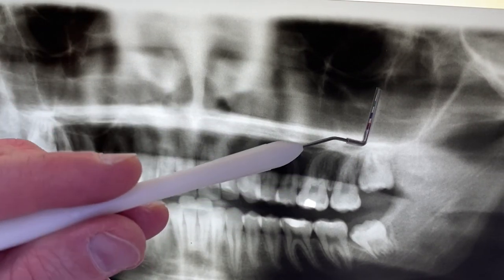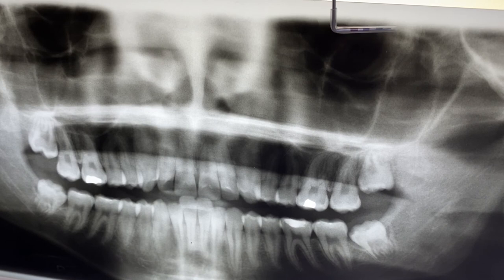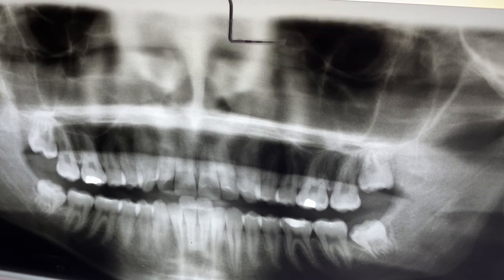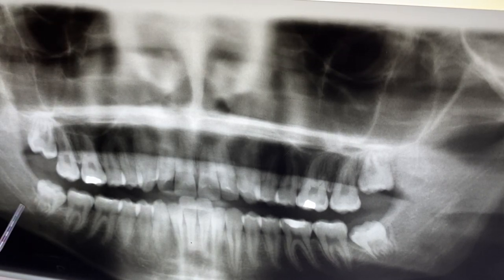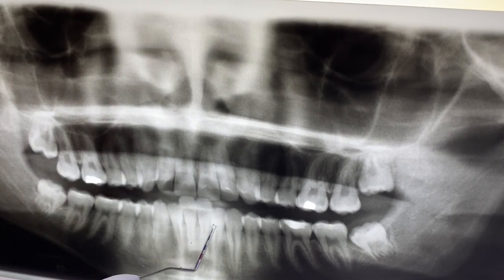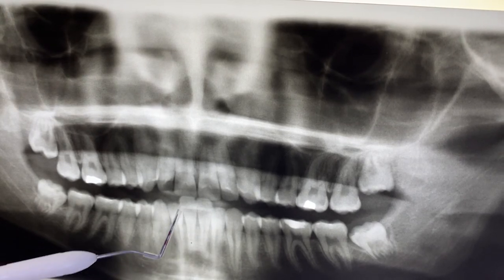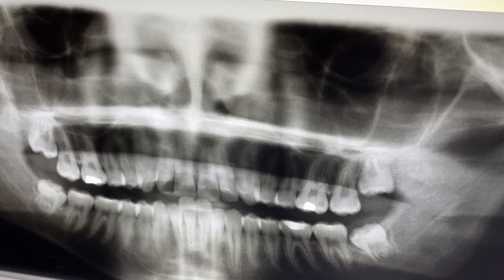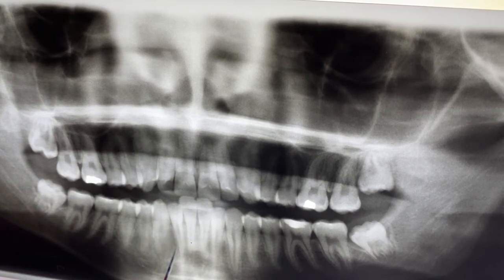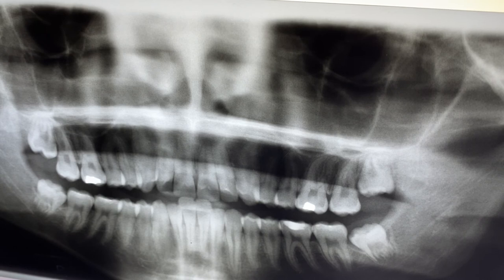This right here is the sinus, and this right here is also the sinus. The orbits would be up here — so this is probably an orbit, that's where the eyes are. As you can see, there's some distortion: these two teeth look like they're jarringly huge, but they're not — they're actually the same size as the others, but they look like they're positioned upwards, and that's not quite right. You can get some distortion with the image, especially in this zone, and pretty much anywhere if the patient isn't quite positioned right.